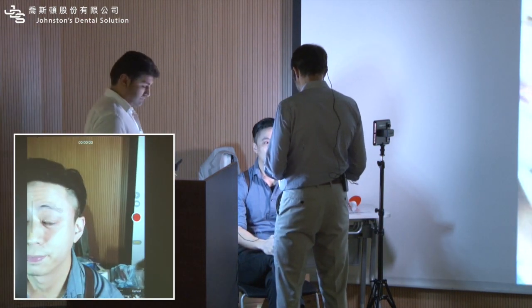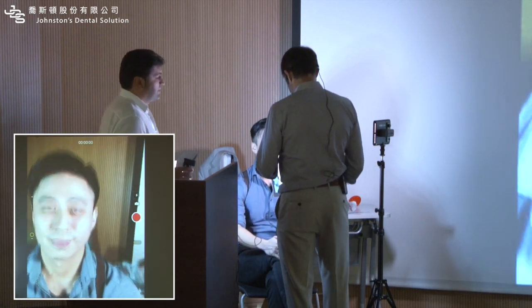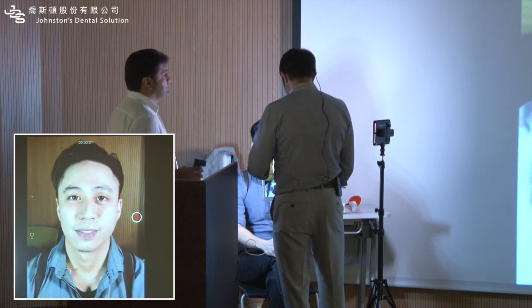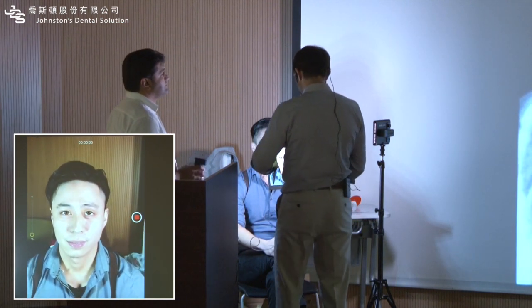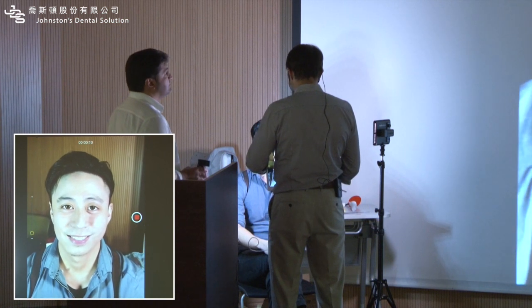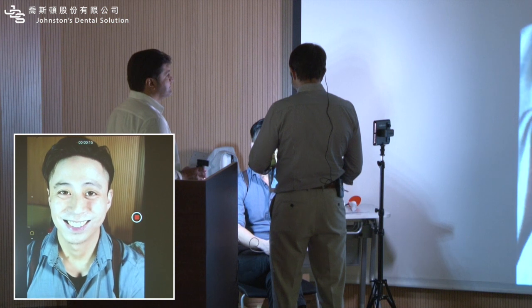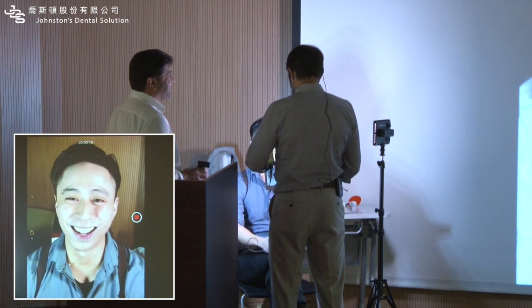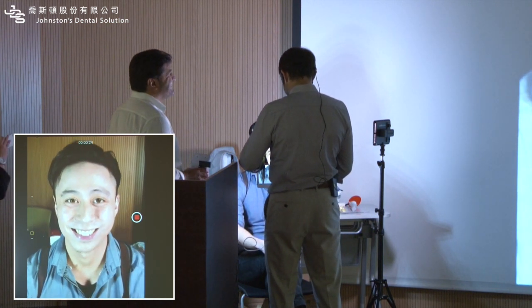Okay? So I'm going to just take the video. And if you can look here to the camera. Yeah. Okay, so I'm going to just record. I don't need to worry about clicking the photo because it's recording the video. Just give me a big, big smile. Stretch. Show a lot of gum. Yeah. More. Come on. Yeah, it's a little better.